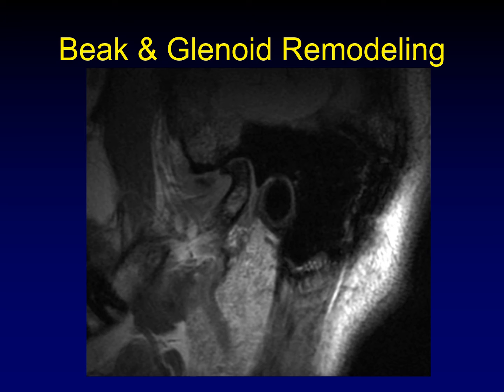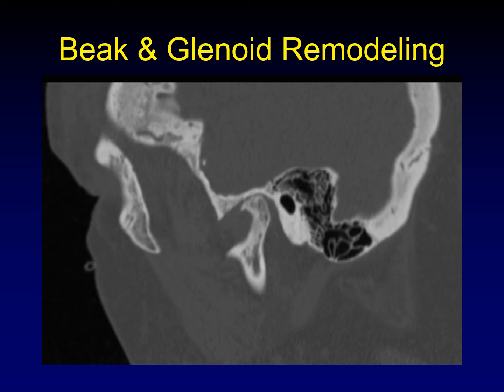In late-stage degenerative disease, the glenoid fossa loses its smooth, cup-like contour and begins to remodel in response to the altered condylar head shape — a very late finding indicative of severe disease. On sagittal CT, you can see the glenoid taking on a flat appearance rather than a rounded cup, with a sharp beak osteophyte off the front of the condylar head.